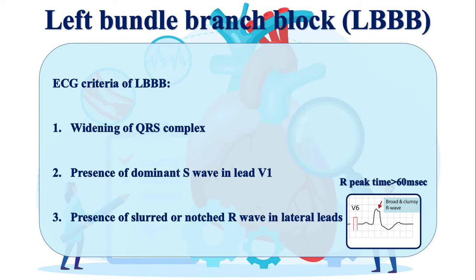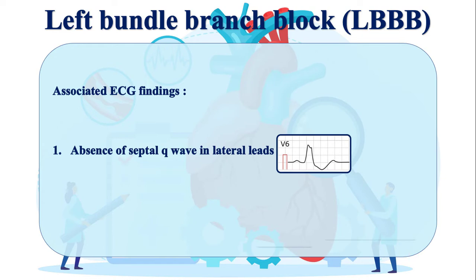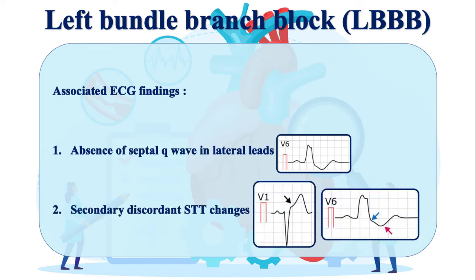In addition to the diagnostic triad of LBBB, there are a couple of associated findings in left bundle branch block as well. Absence of septal Q-wave in lateral leads and secondary discordant ST segment and T-wave changes are two very common associated findings in LBBB.